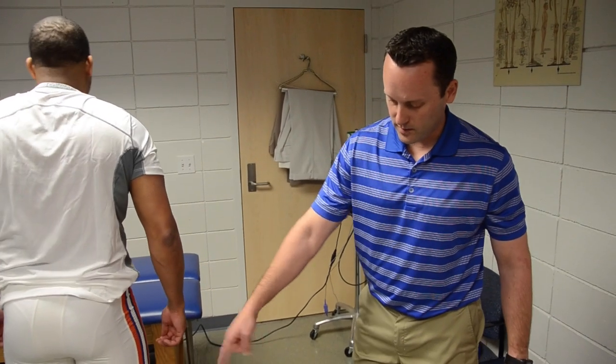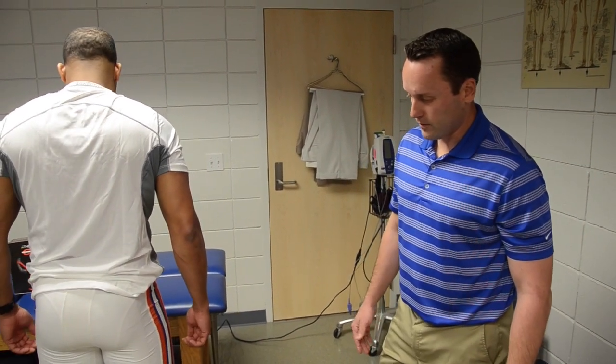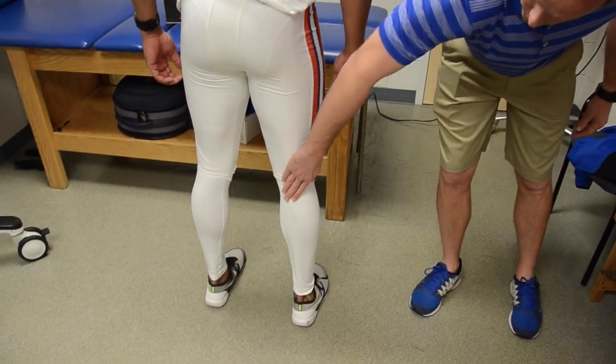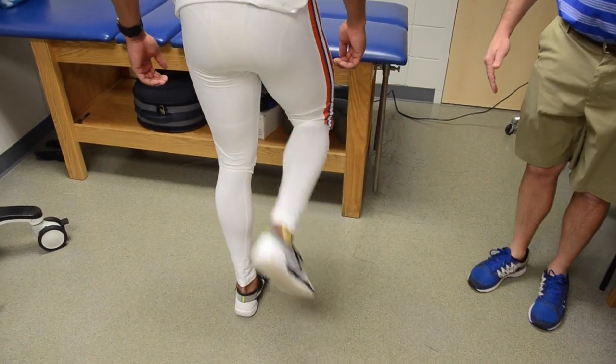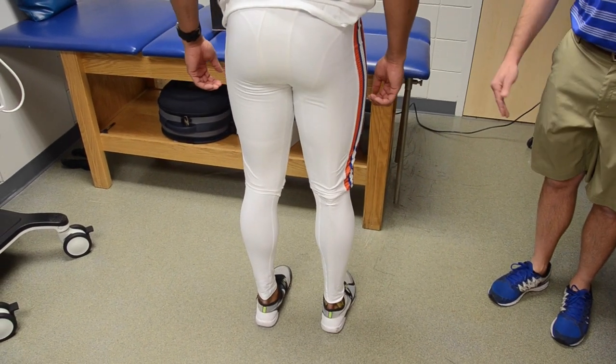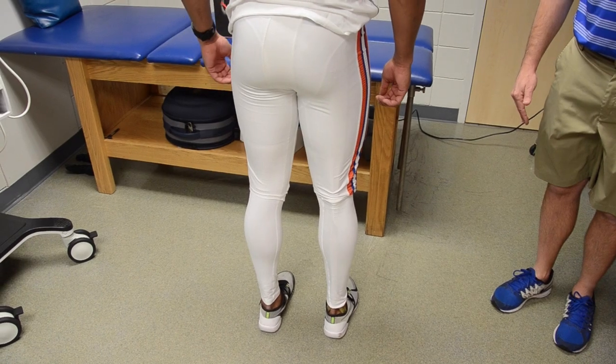If it shows in his cleat, we'll do a cohesive tape, spat tape around it, and ready to go. You can see some of the tension that's on here right here. If he goes ahead and does a curl, you should feel like it's pulling his heel off the ground, acting like a hamstring.